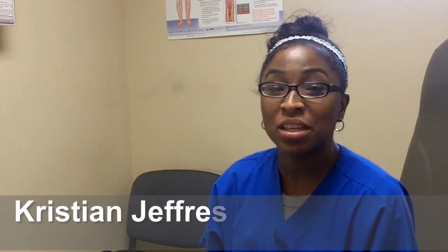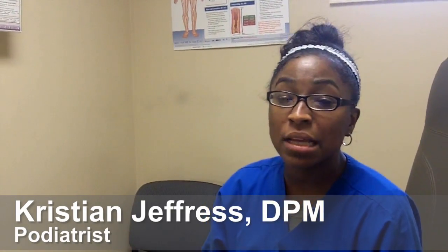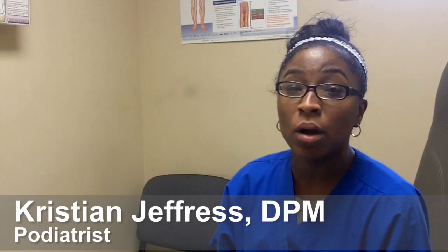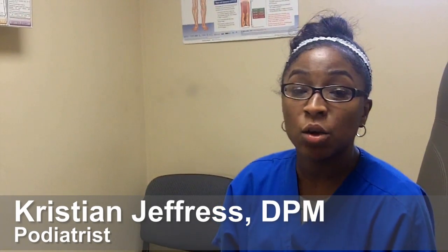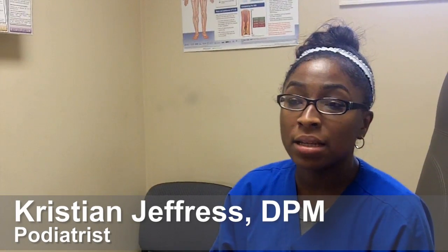Today we're going to treat a patient using the QClear laser on a plantar wart. This patient has been treated previously using CO2 laser as well as surgery, and things have been pretty ineffective for her. So hopefully using this QClear laser we will thermally get rid of the verrucous tissue, or warty tissue.